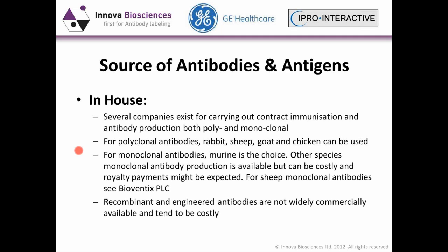And the other choice is recombinant and engineered antibodies, but these are not really widely commercially available and tend to be very costly. And also I need to mention that monoclonal antibodies from other species tend to be protected by patents, and there will always be a possibility of having to pay royalty for using these reagents commercially.